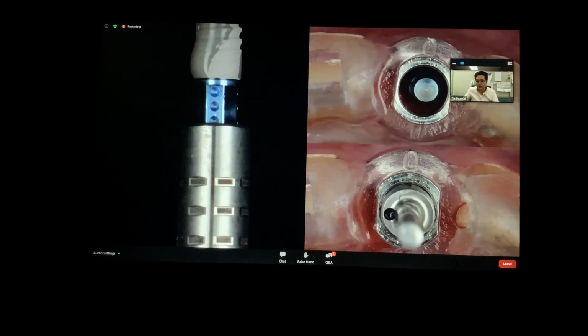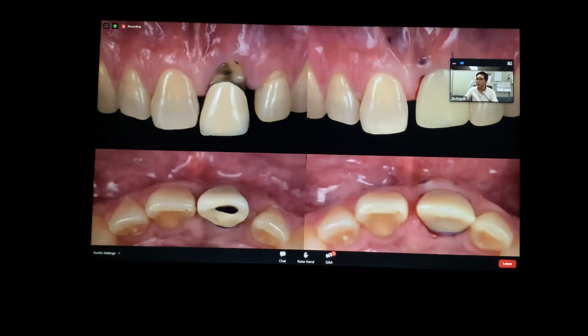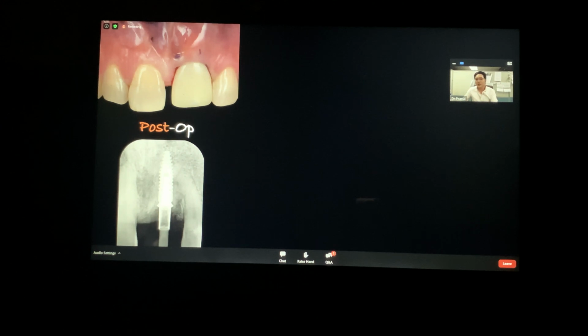This is what you want to see after the surgery. With that, we performed a soft tissue graft and bone grafting. Sorry, I don't have the picture for that, but this is what we have at the end. This is right after post-op. This is the X-ray of the post-op. Then we wait. We asked the patient to come back 2 weeks later, and unfortunately, a complication happened. For the case that you want to use to present, there is always a complication that happens. I don't know why. It might be just me, but this always happens. What we have 2 weeks later was this.